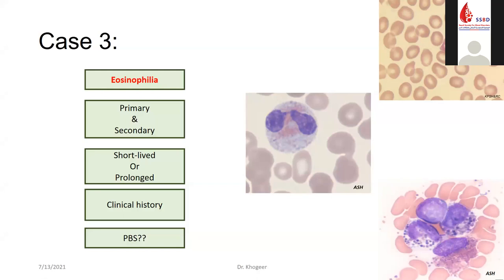Again, examination of the peripheral blood carefully, especially the tail and the edges of the smear, is very important, as it may reveal some parasites. If a clear reactive cause is not identified, further investigation, including a bone marrow biopsy, cytogenetics, and other molecular testing, should be performed. Overall, eosinophilia is reflective of a variety of processes and requires a thorough investigation and clinical correlation.